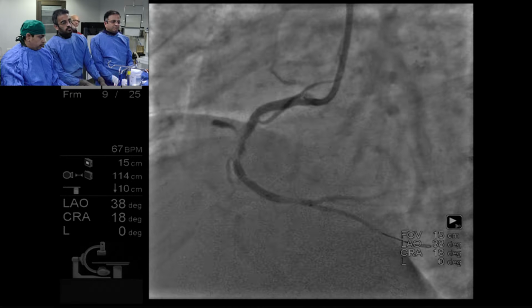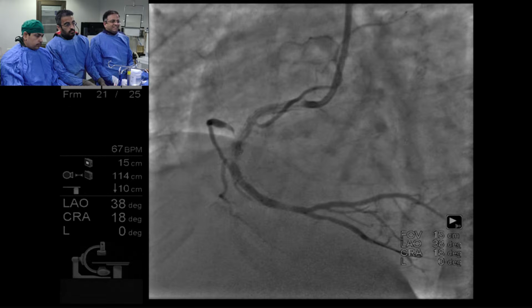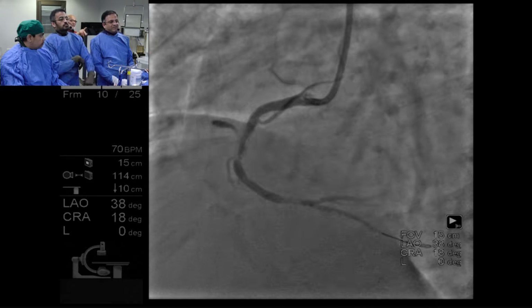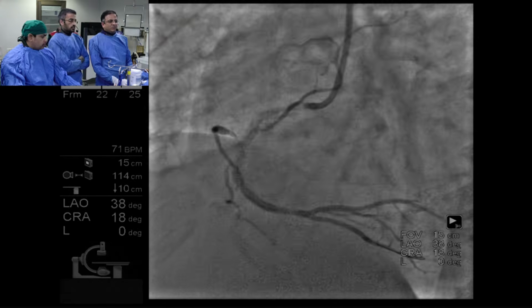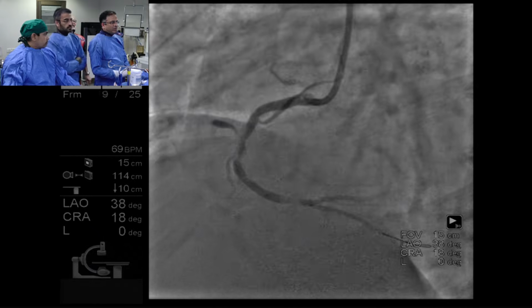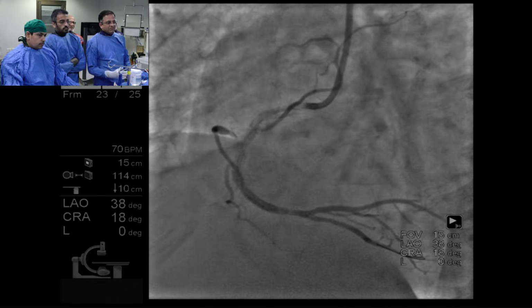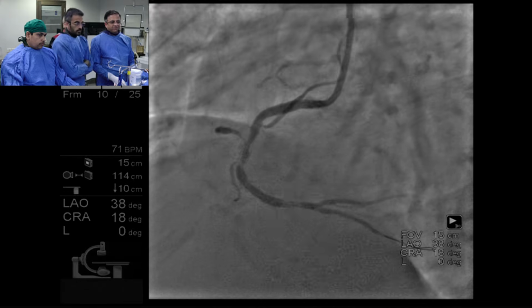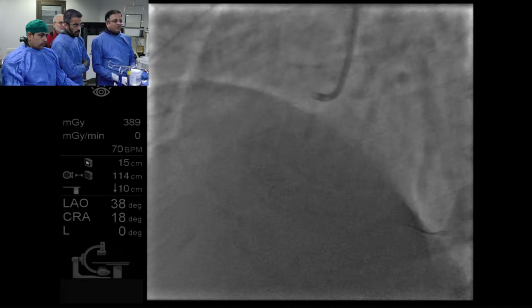Tell us what you are going to see in this distal lesion. Because there is watermelon seeding and no calcium is seen, I think it is a predominantly fibrotic lesion. Now we have treated a 15 millimeter segment, so I'll take a 15 stent, even though I probably could have gotten away with a 12 millimeter stent. Yeah, that's fine. But we'll take a 15 stent, right? So we're going to take a 3.0x15 or 2.75x15. We'll take the middle part also on our way out.